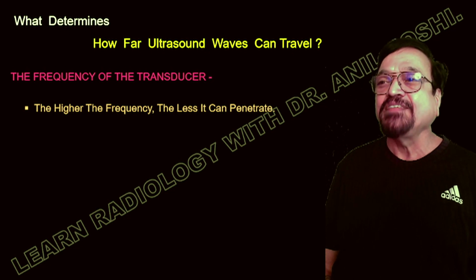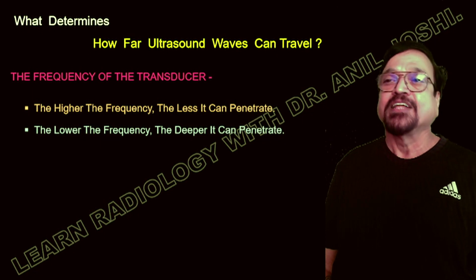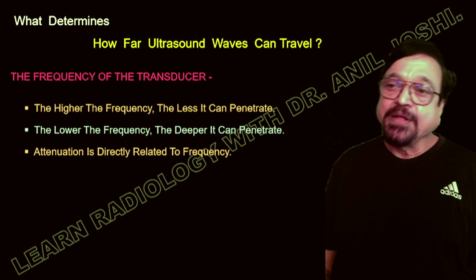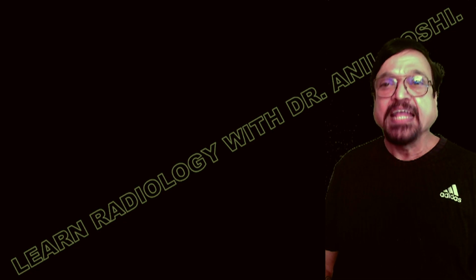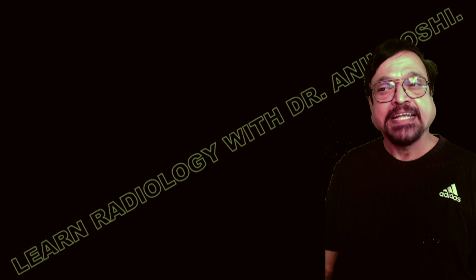Now, the higher the frequency, the less it can penetrate. Sound waves will penetrate less. The lower the frequency, the deeper it will penetrate. Now, attenuation is directly related to the frequency. Now, the higher the frequency, there will be high attenuation. So, it will not penetrate deeper.